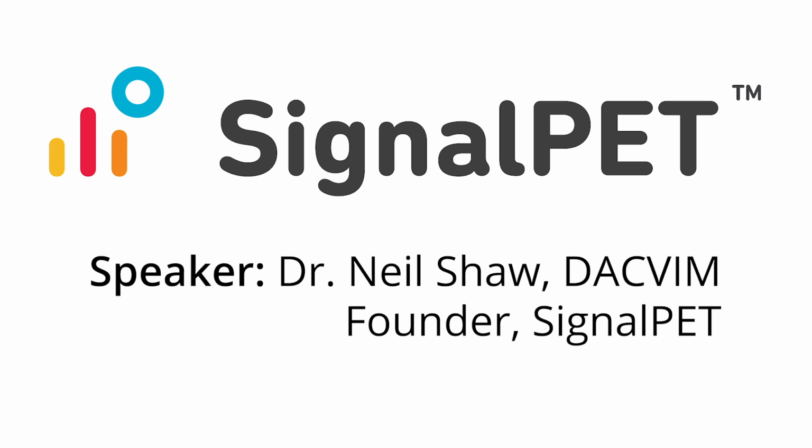Chealsea is going to speak with us today on pulmonary patterns, specifically pulmonary parenchymal patterns, and the classification of pulmonary patterns in order to have a uniform standard by which films are viewed and assessed, to assist veterinarians in providing them with more information. So I'll turn the mic over to Chealsea. Thank you, it's all yours.